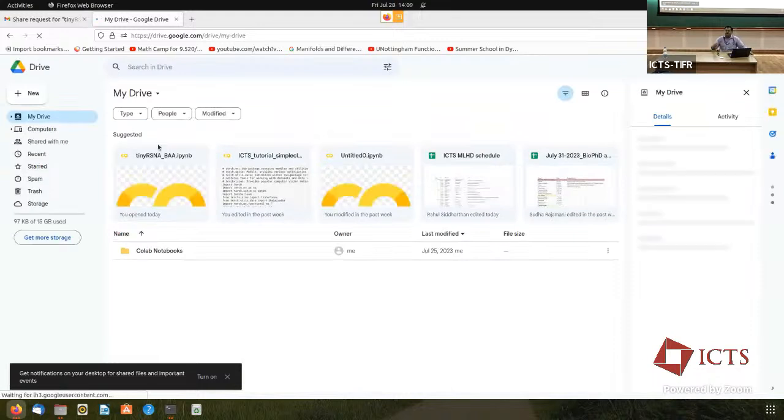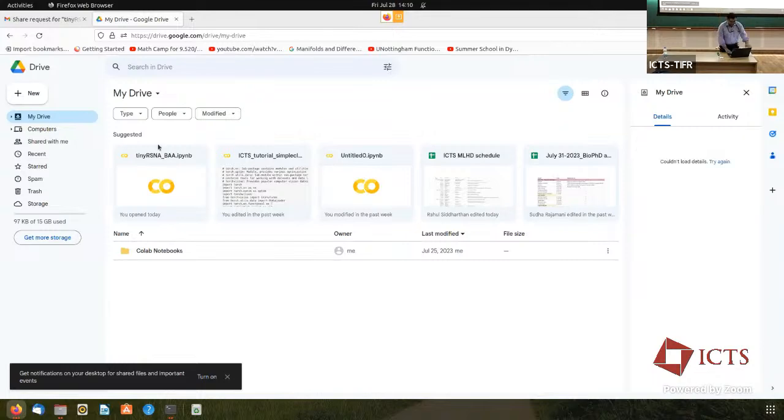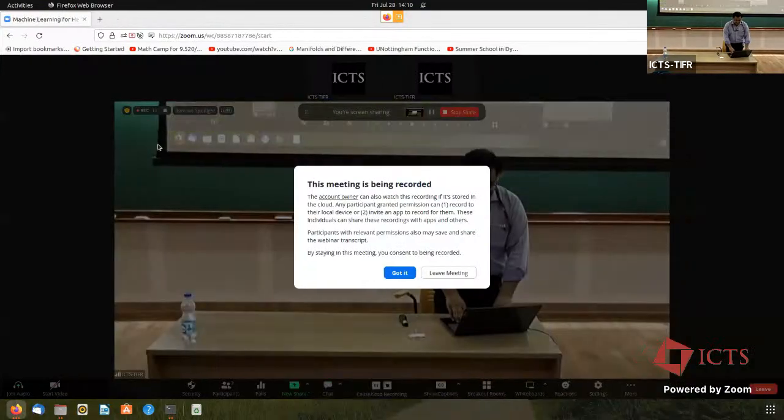Actually, I'll do this in a minute. Why don't you guys get started on writing the code, and then I'll share that. I'll make it shareable. Please don't send me any more emails. I'll make that link available. Anyway.